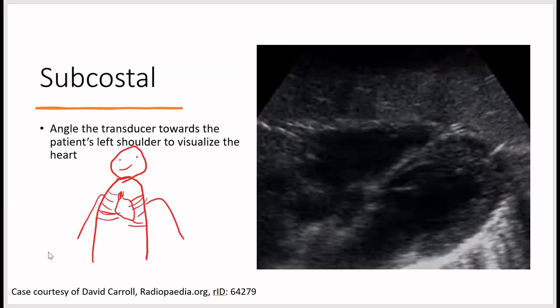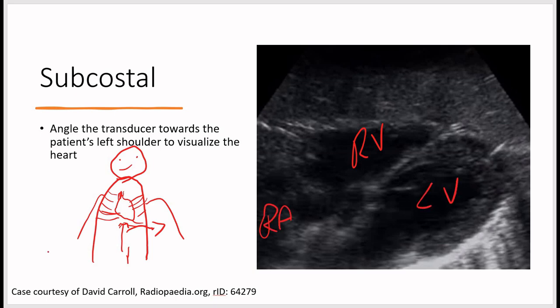For the subcostal view, position the transducer in the substernal area with the marker pointed toward the patient's left and the tail dropped down at an angle. Structures visible include the right ventricle, right atrium, left ventricle, and left atrium.